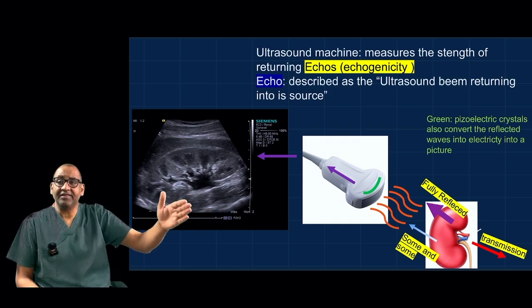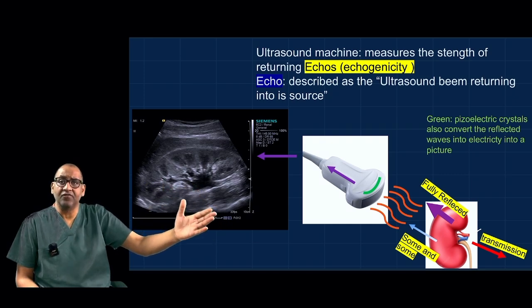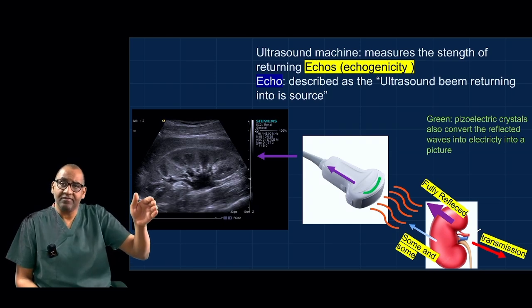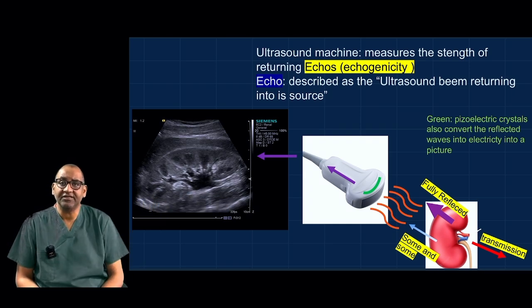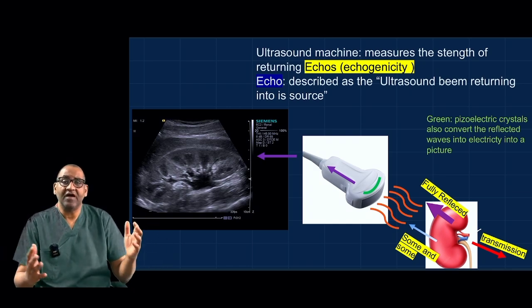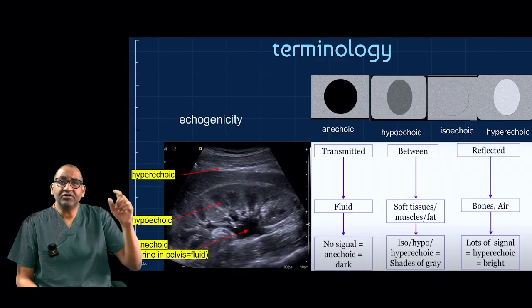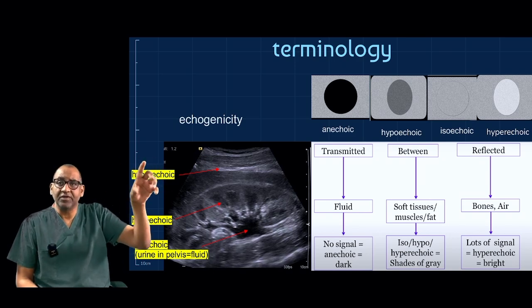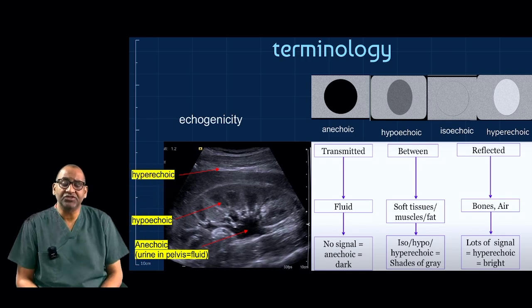We have multiple options. The sound waves either hit a medium that reflects the whole sound wave backward, or sometimes they go through a medium without any reflections, and in between, they tend to vary. Each reflection will give us a dot on the image, through which we have an image which is a mixture between black and white, as you can see.